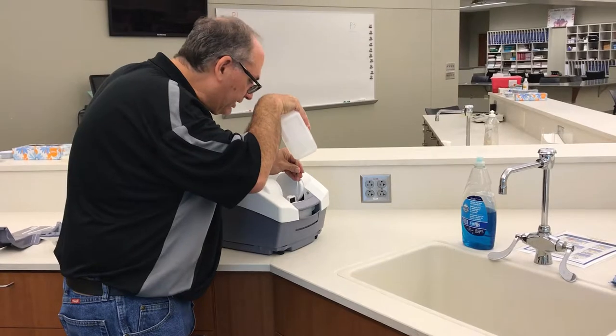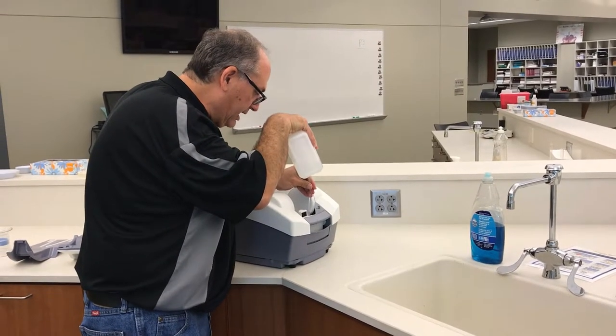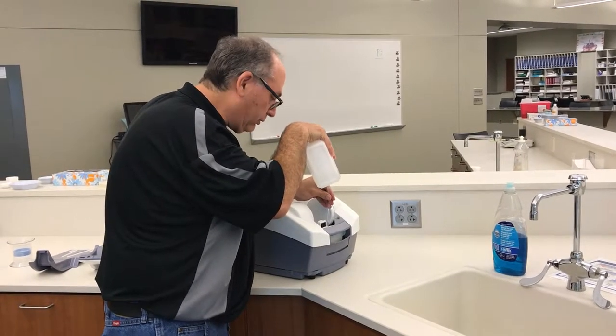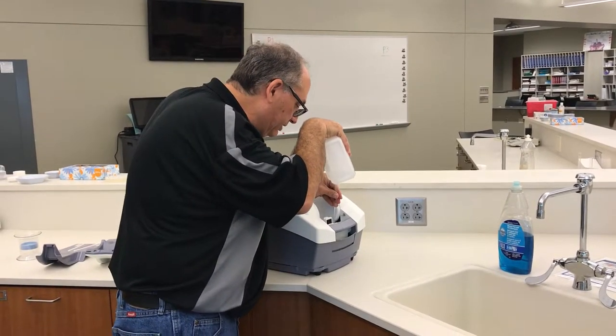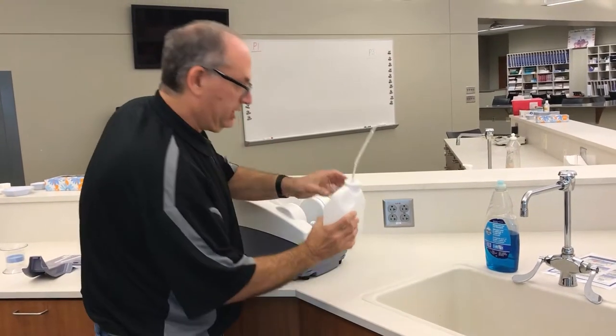This also emphasizes why it's extremely important — it's an expensive, sensitive device — that you never leave this machine in a car or let it get too cold. That water could freeze inside the machine and that would destroy it. So remember there is water in the machine at all times.